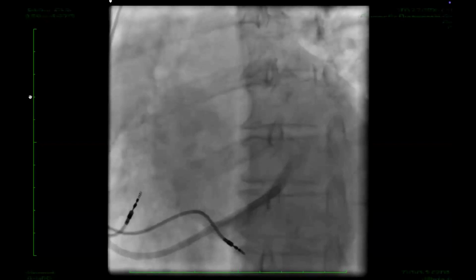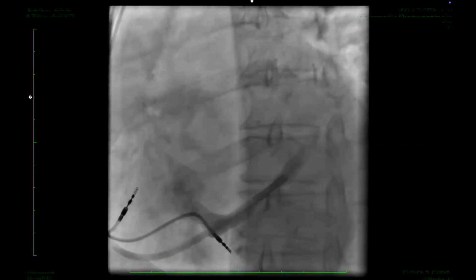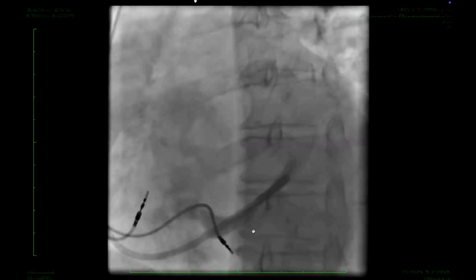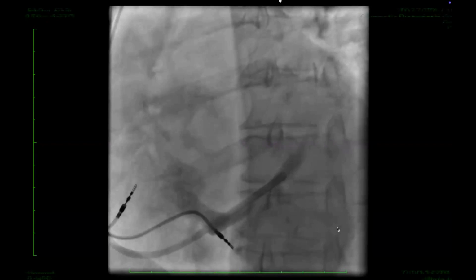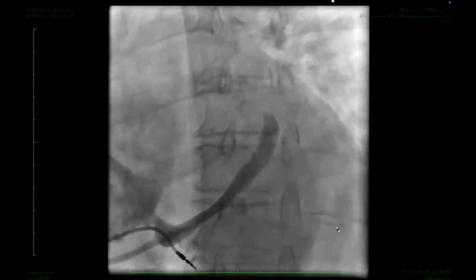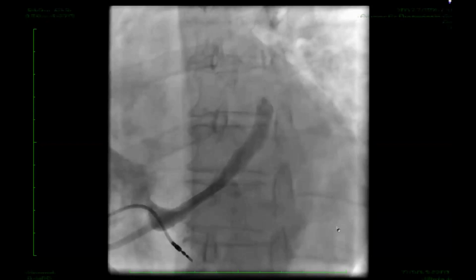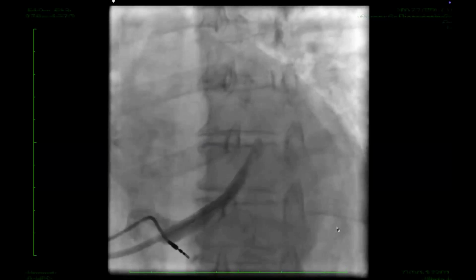And there's a venogram, and you can see a lateral branch appearing very early. It's a little bit tortuous, but it's sitting over here. There's another branch that comes below that probably is a middle cardiac vein, but an early branch of that middle cardiac vein is a lateral branch. And a lazy operator like myself would probably try and exploit that lateral branch, pull back on the guide cath. So here I pulled back on the guide cath to try and see if I could get it to just drop into that vein.